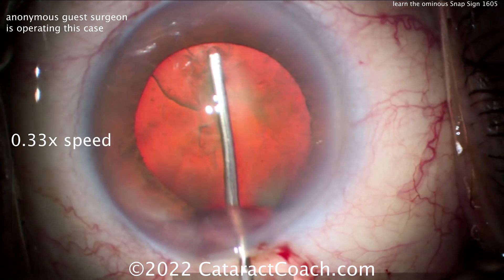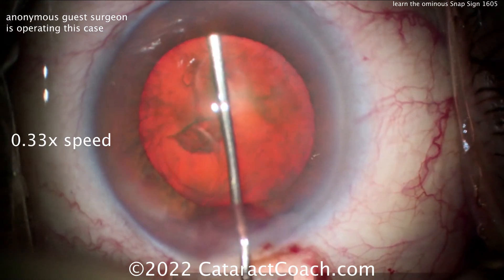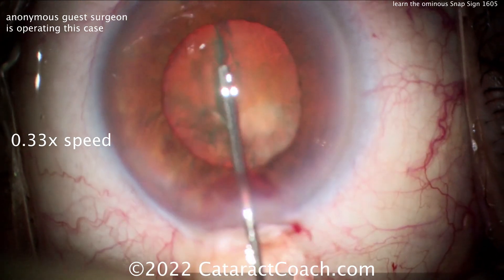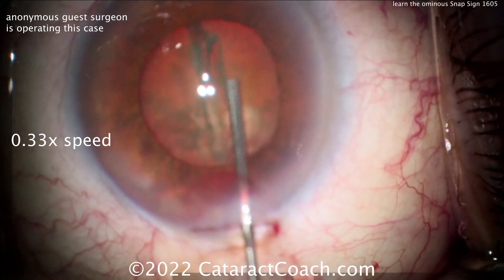Watch again in slow motion. So hydrodissection coming across the nucleus, the cannula is holding the nucleus back — and there. The pressure releases and everything snaps when the posterior capsule blows out.